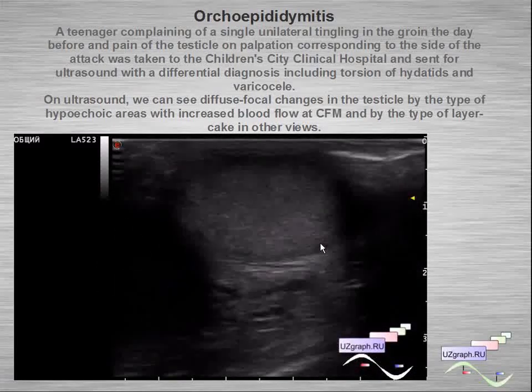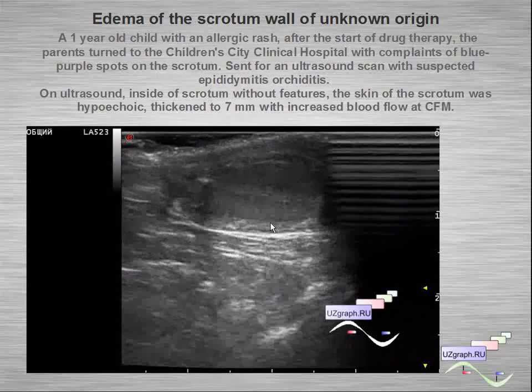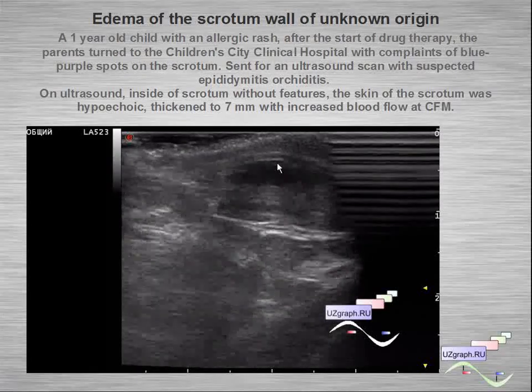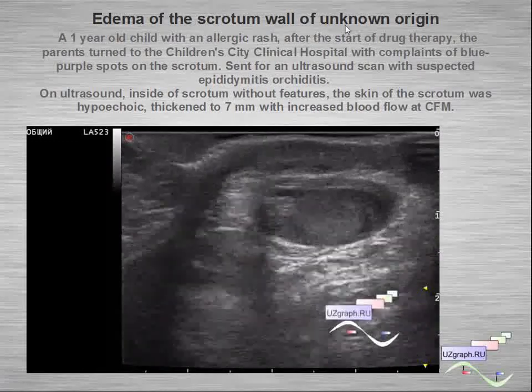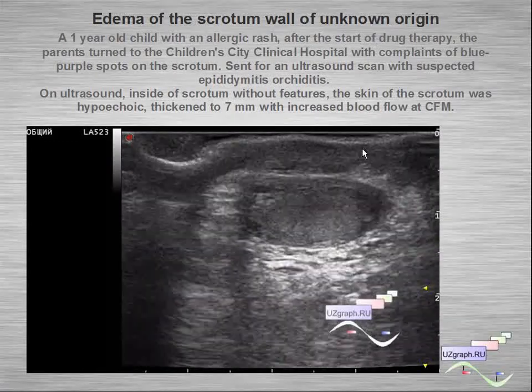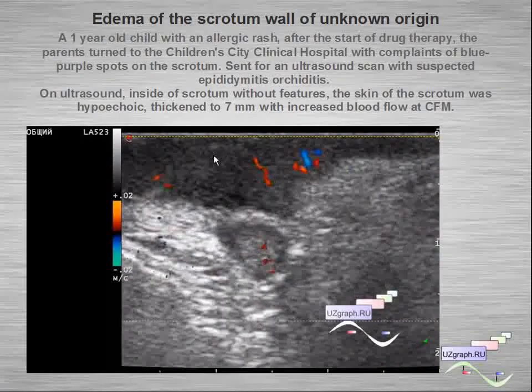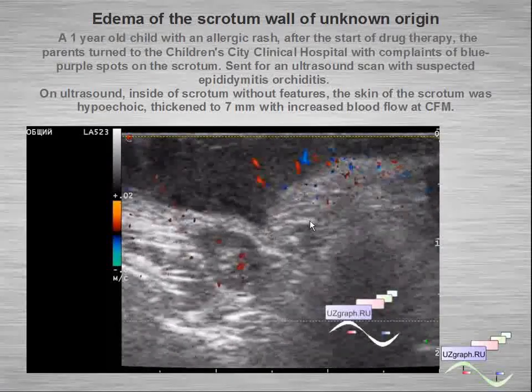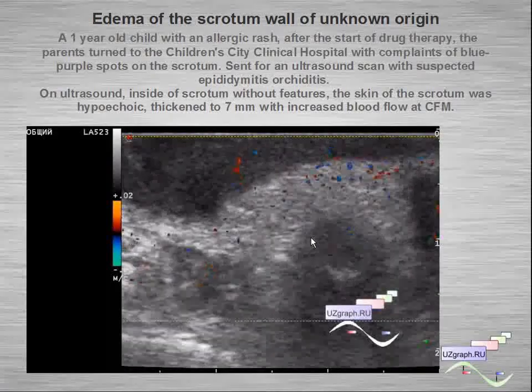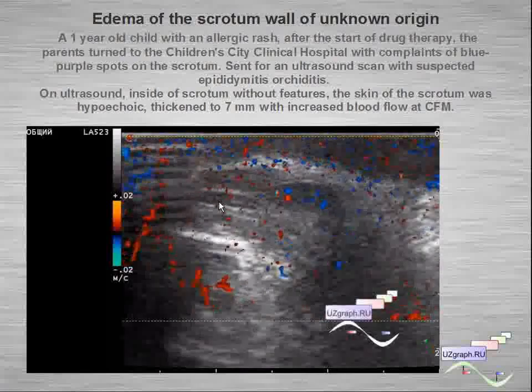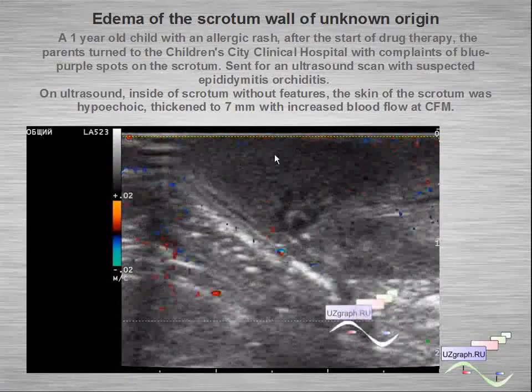Another example of acute scrotum: this is edema of the scrotum of unknown origin in a one-year-old child. We can see a completely normal testicle with only a thickened scrotal wall with increased blood flow at color flow mode.